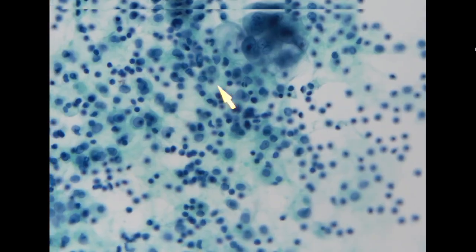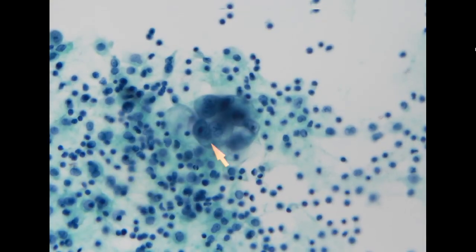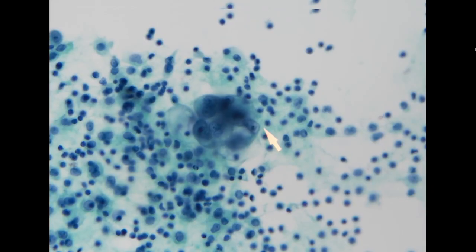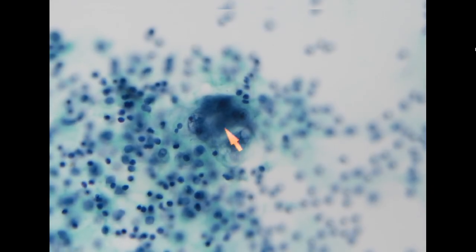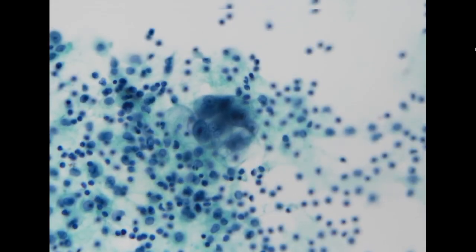Indeed, these cells harbor a very similar cytomorphologic pattern. Large nuclei with vesicular chromatin, prominent nucleoli, three-dimensional arrangement, and bubbly cytoplasm. So this is consistent with metastatic adenocarcinoma.